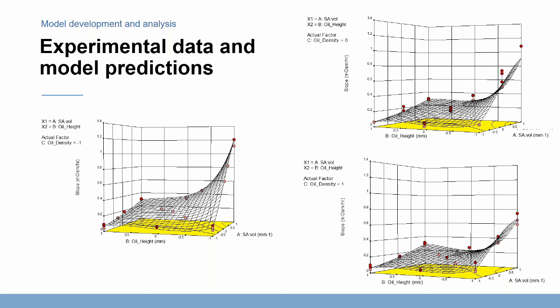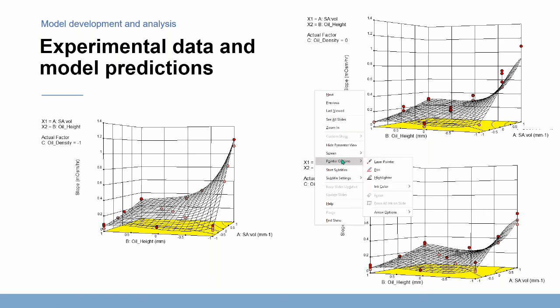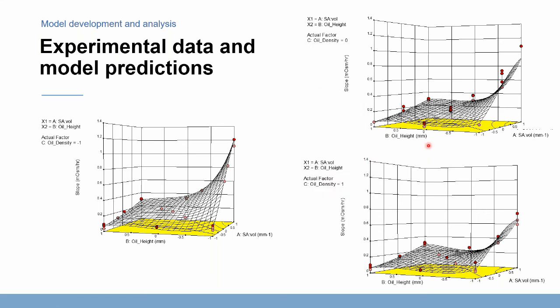when we have replica points, which you can see a few here and here on these corners, the points themselves are pretty tight. There is more noise in the data when you get to some of the extremes, like we see out here on the far right. And my pointer's on the wrong screen. Sorry about that. Can you see my pointer now, or did it somehow change back to a pointer, not a laser pointer? So let me do this. Yeah, we can see it.